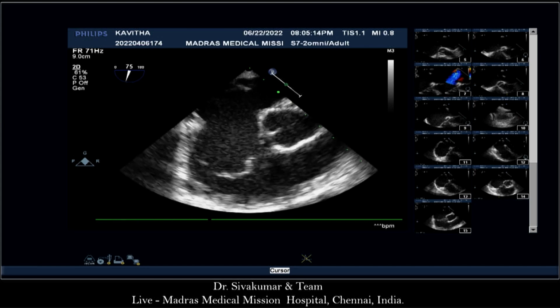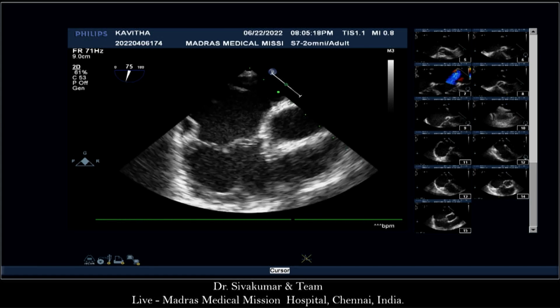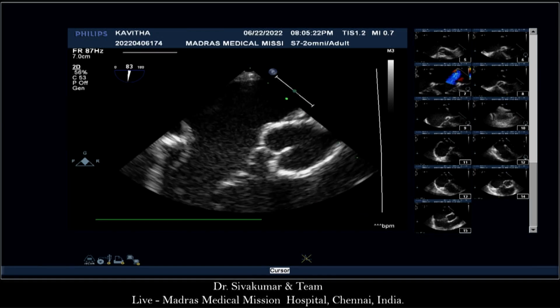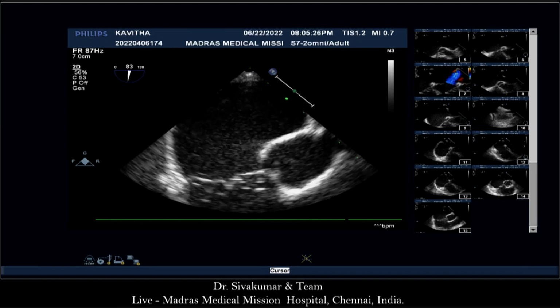Can I just ask, it's Iqbal here, can I just ask a question? Can you just do that measurement again? I was interested to know where you measured to. Is this an offset septum? Because you measured off where I thought you might. Yes, actually, sure.